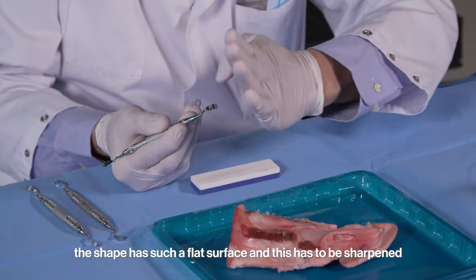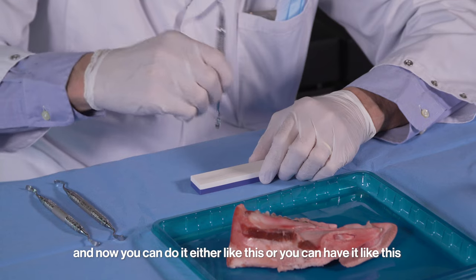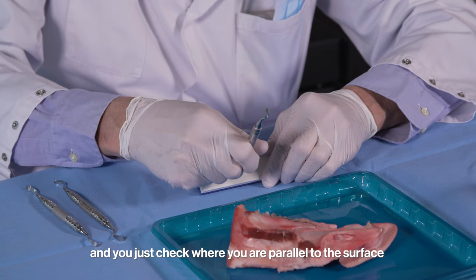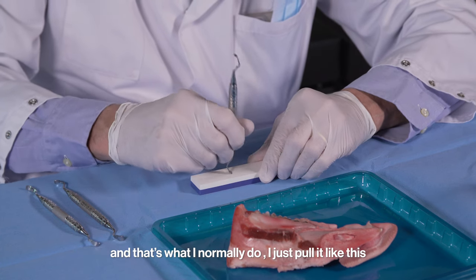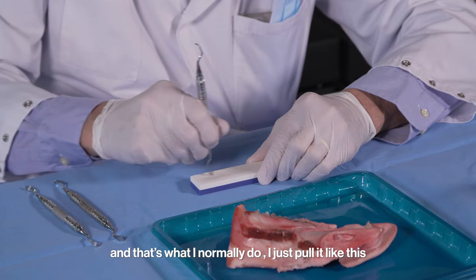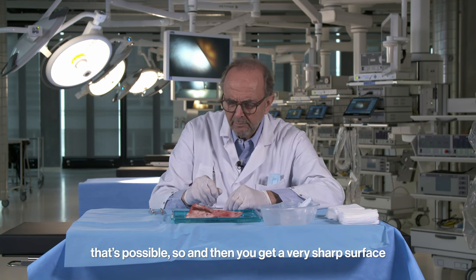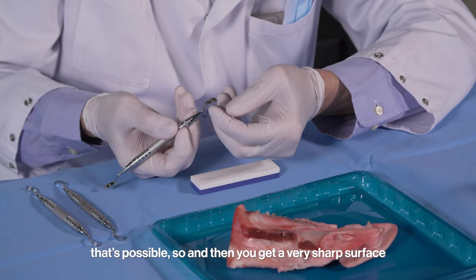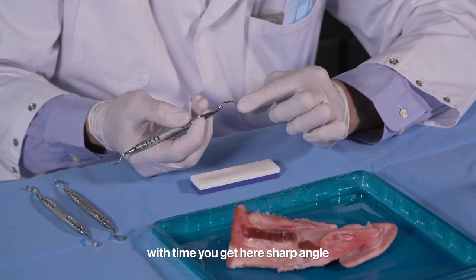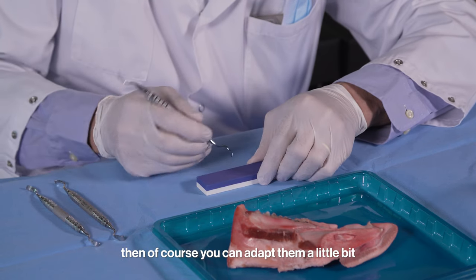The shape has a flat surface and this has to be sharpened. You can do it either like this, or you can hold it like this and just check where you are parallel to the surface. Normally I just pull it like this. You can also use some liquid — that's possible. Then you get a very sharp surface. If over time the edges become rounded, you can adapt them a little bit.